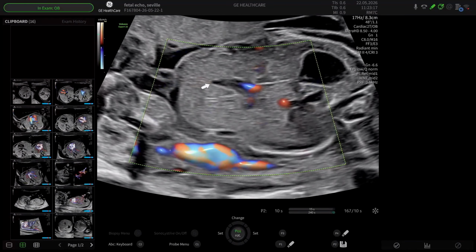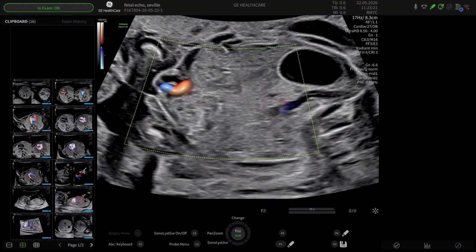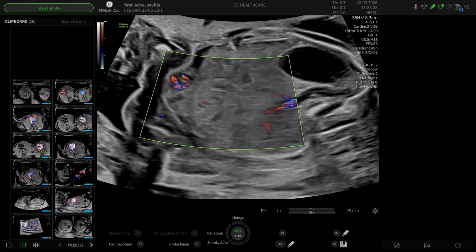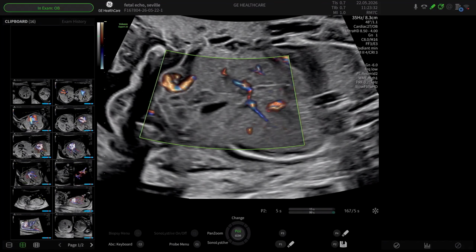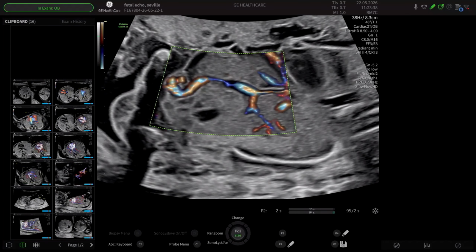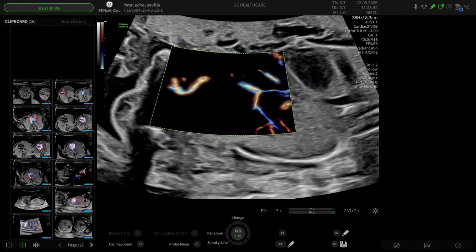When you're having difficulty in visualizing the intrahepatic vein, which does happen quite often, this is where my friend slow flow comes in, because when you press on the slow flow, it will demonstrate the vessel and the branching of the vessel as it comes in, and you can see the ductus venosus. You will see, by the way, when I'm imaging, there's like a background. I did not mention this earlier, but there is the option to turn your background off to show your vessel.